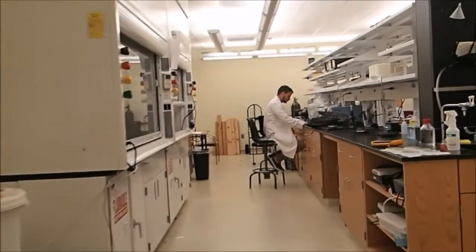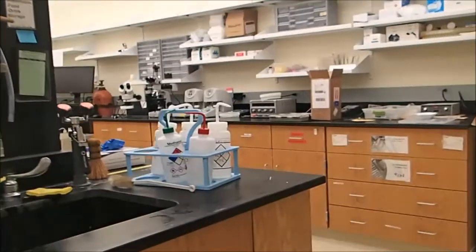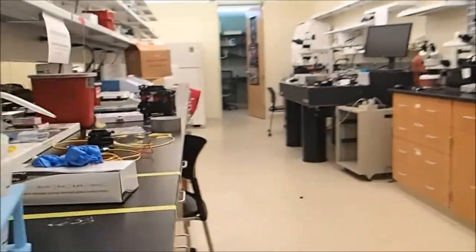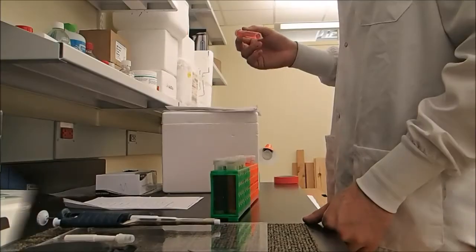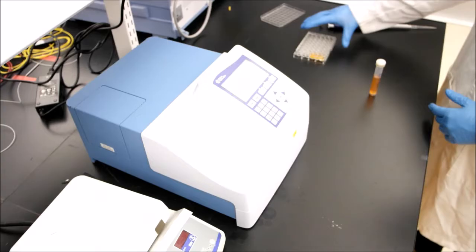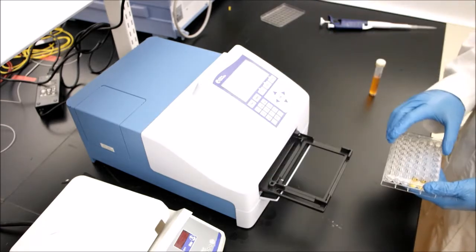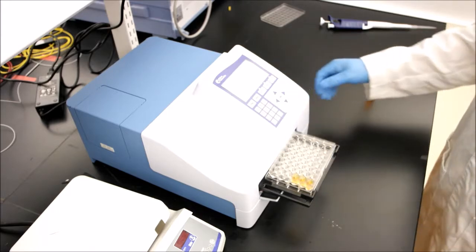Here in the lab, they perform multiple biological sensing experiments, including ELISA tests and blood tests. ELISA stands for Enzyme-Linked Immunosorbent Assay and is a versatile test for pathology. The test requires a liquid sample from a patient and uses it to check for antigens via an antibody assay. The traditional method used to run ELISA assays uses expensive and cumbersome medical equipment.